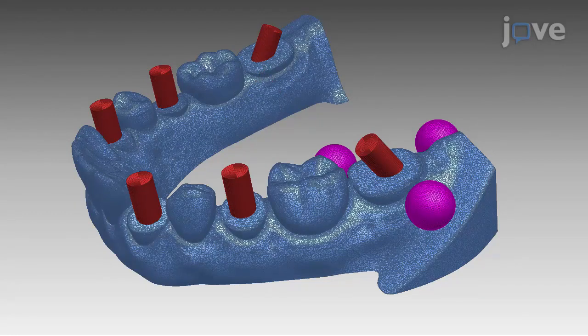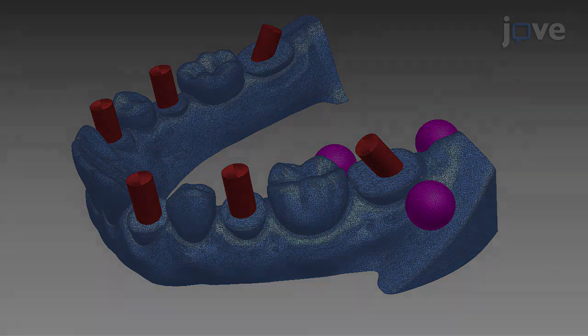To define the coordinate system, add 3 3.5 mm reference spheres posterior to the left second molar cylinder with one sphere on the buccal side. Use this design in a metal 3D printer to manufacture a cobalt chromium alloy phantom model to serve as a patient's dentition.